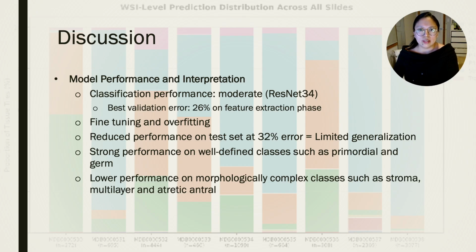When we moved into fine-tuning, performance declined rather than improved, which was interesting. The model became too overfit, which indicates that additional training may have disrupted useful feature representation instead of refining it. In this case, the pre-trained network appeared to be best for our goals given the dataset.